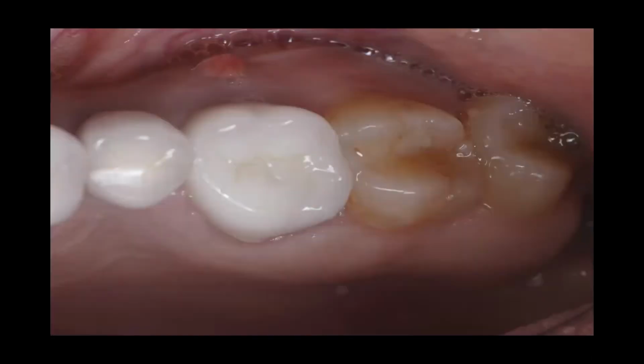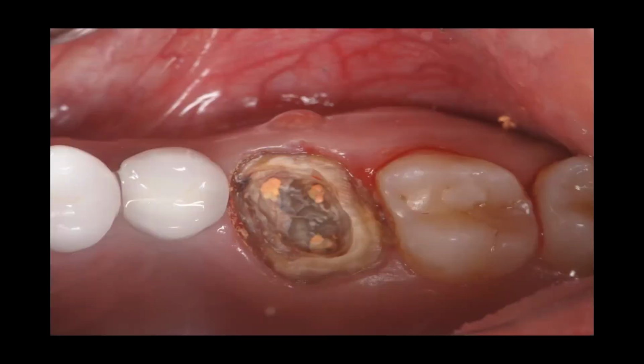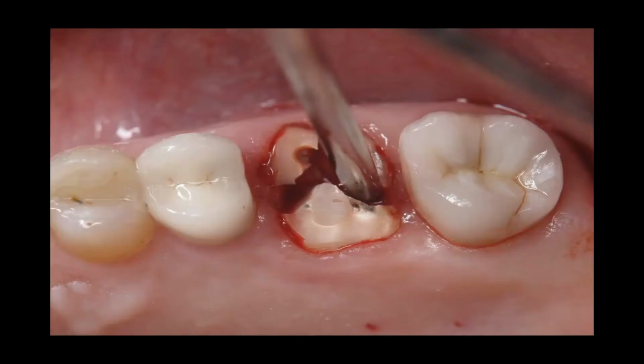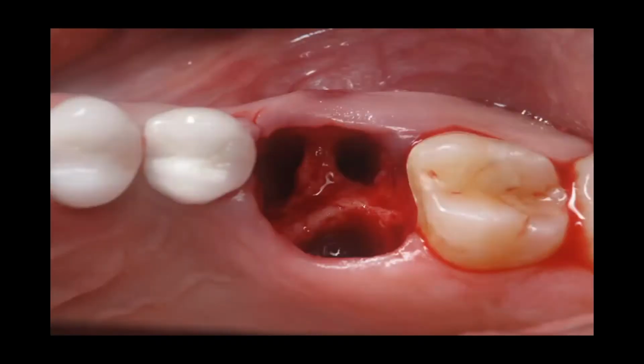Here's a picture a friend of mine gave me. We're taking off the crown. You can see a fistula on the buccal. This is a great picture because you can see the three roots where the three root canals are. We're going to section from buccal through the furcation down to the central groove. We veer off to the mesial, veer off to the distal, section like a peace sign, and take out each root individually, preserving the bone quite nicely.